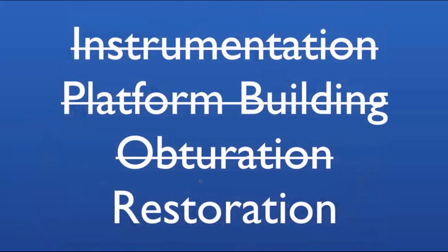Okay, so we reviewed these three components. Let's talk a little bit about closing an access cavity. I'm not sure how many of you are doing some final access closures or buildups, and both Mark and I, this is a big part of our practice. At the end of an endodontic procedure, we really try in all instances to close the access cavity and to seal the work prior to the patient getting a crown. Some cases they're not getting a crown right away, so it's been a passion of ours.